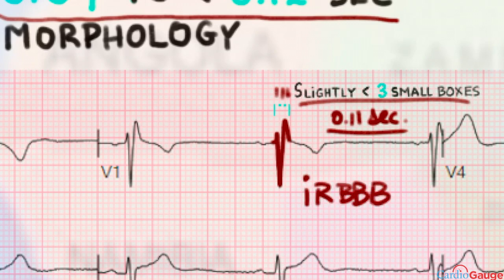And that's super common, and you could think of it as a normal variant. Oftentimes, or in fact most of the time, it's not associated with pathology.